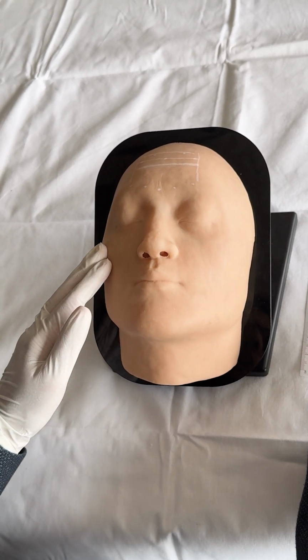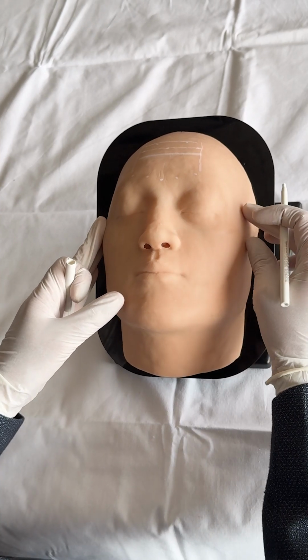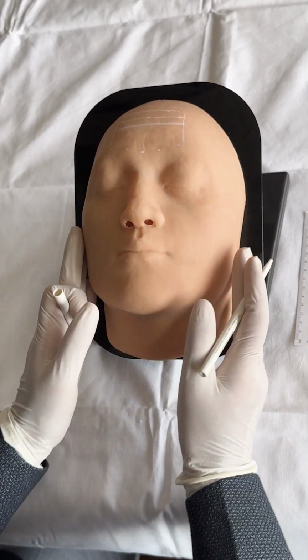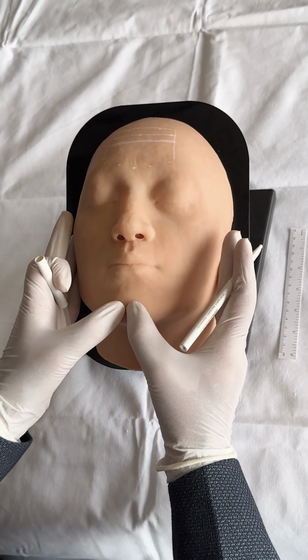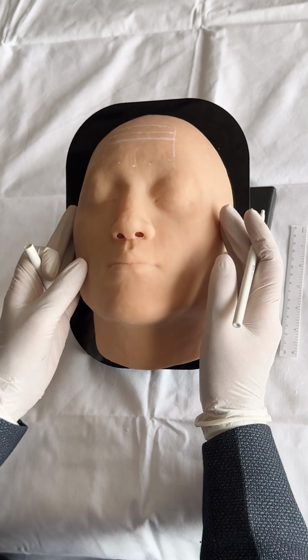Do the markings in a similar way as we did for the botulinum toxin. One can perform wherever they want to do the fillers, for the cheek augmentation, to give volume to the face, temples, or in the lower part of the face. All these areas are very easily palpable. If you have done the palpation in the correct way, you can very easily notice where exactly the bony points are.